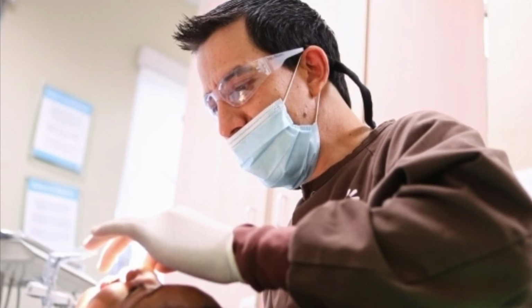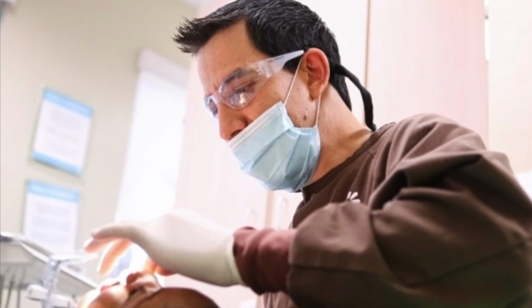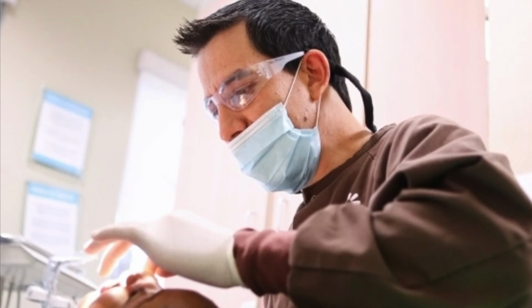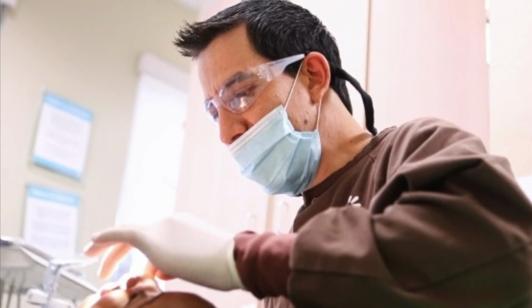Initial size. What is the initial size? It is the first instrument used to fit the working length. It has a slight resistance. This is the initial size: the first instrument used to fit the working length and have a slight resistance.